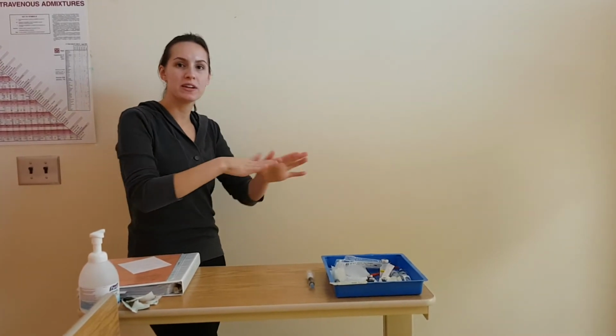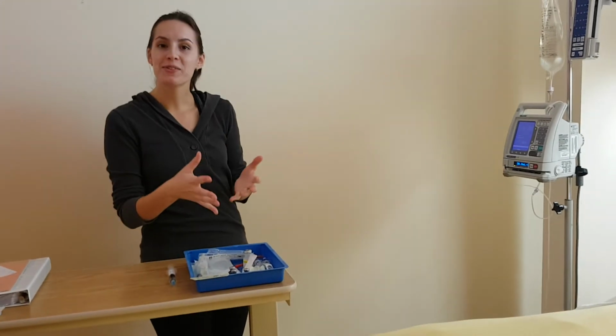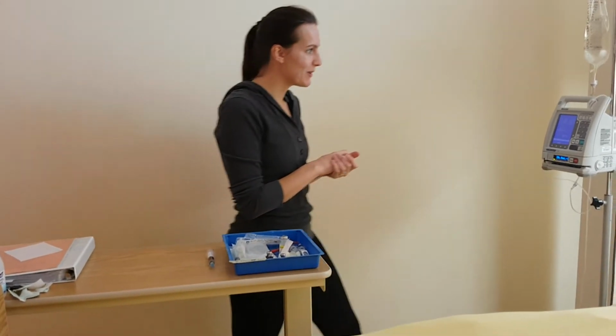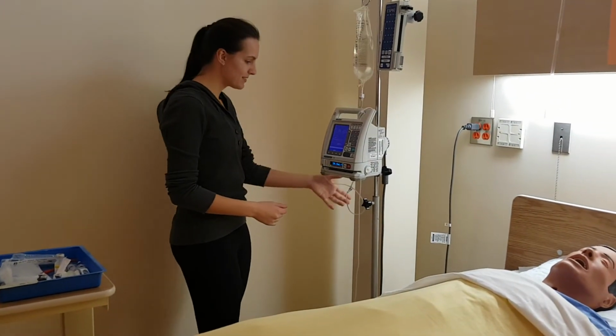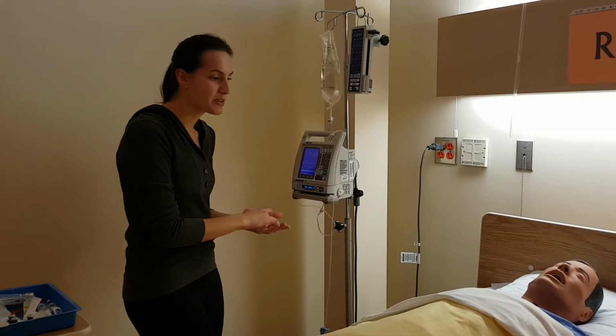As I enter the patient's room, I'm performing hand hygiene and I'm doing a general safety check. There are no tubes or drains lying around. The patient has no visible distress. The room is clean and the side rails would be up. And I'm going to inspect my primary bag here. Primary bag's good, the tubing is intact, and it's running at the correct rate.